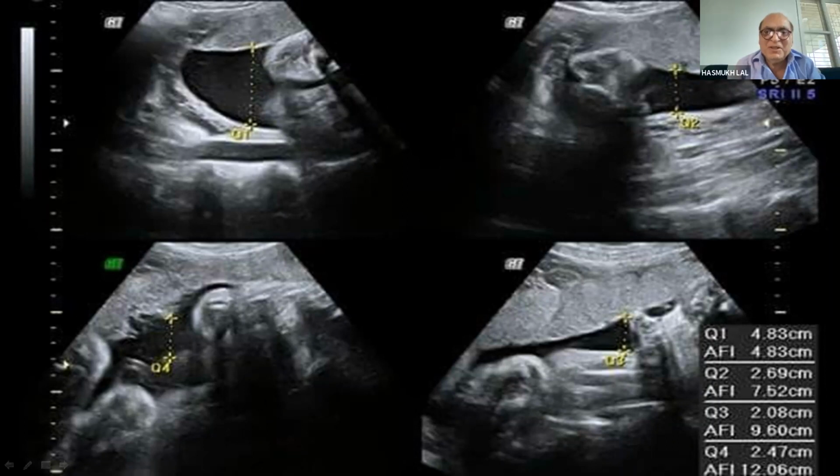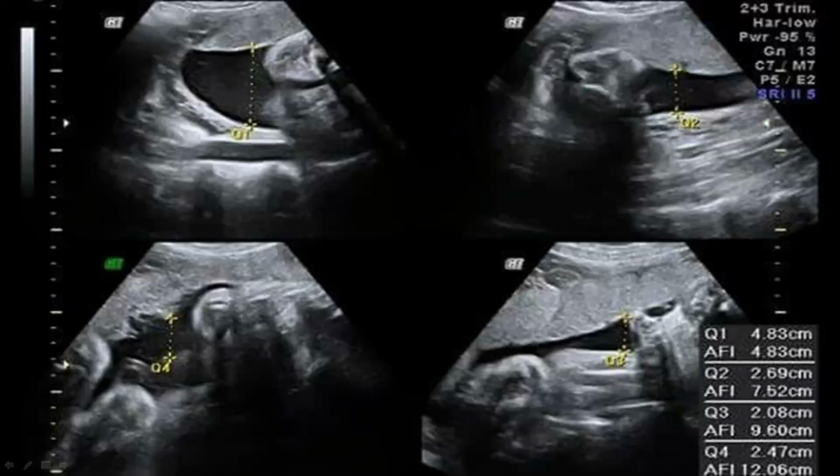Number 4 is for detecting the cardiac activity. The transducer has to be in transverse position just above the symphysis pubis and is moved in the mid-abdomen towards the umbilicus, maintaining a transverse orientation. A is the correct answer. The difference is from 48% correct response in the pre-orientation poll questionnaire to 77% post-orientation. Again, very good job.